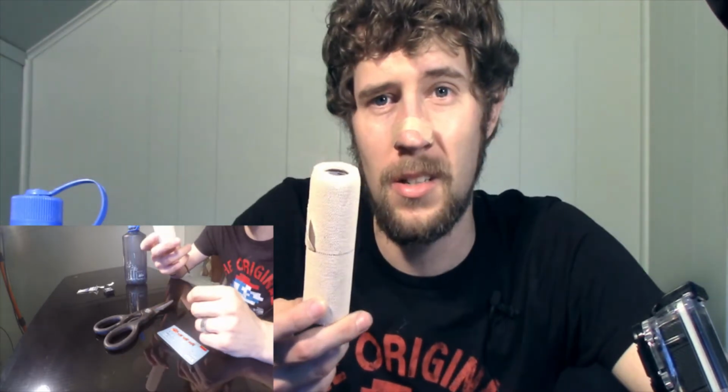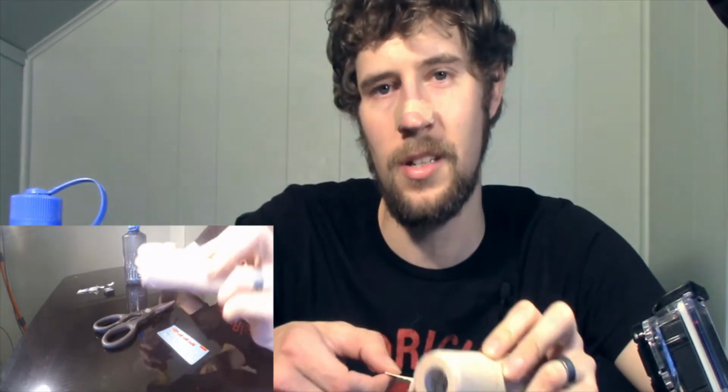All you need is an old credit card. It's expired, so you can't use it. A pair of scissors, and some sort of tape that actually works. You could use electrical tape, which would probably be uncomfortable because it's really stiff. I prefer bandage tape. It's an incredibly elastic material, and the only negative is that unlike the commercial nasal strips, it sticks to your nose and leaves residue all around it. So if you use it at night for things like sleep apnea, you're going to wake up with some gunk on your nose. So hopefully you take showers in the morning, or you like to wash your face.